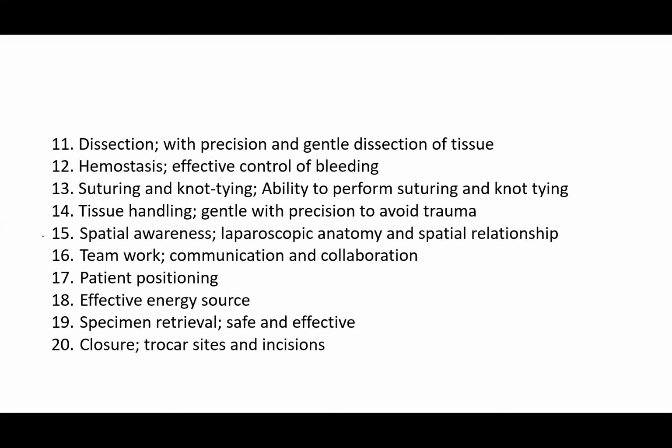Then your dissection should be with precision and gentle dissection of tissue. Hemostasis: there should be effective control of bleeding, and suturing and knot tying. You should have the ability to perform suturing and knot tying, and this is actually dependent on your extent of involvement in the practice. Tissue handling should be gentle, with precision, to avoid trauma.